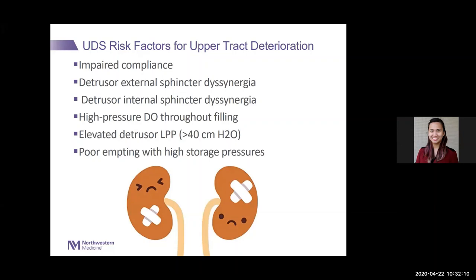So if a patient's trying to void and the outlet is staying closed, that pressure is being transmitted to your kidneys. Detrusor internal sphincter dyssynergia, similarly the same thing. High pressure detrusor overactivity through filling and elevated detrusor leak point pressure.